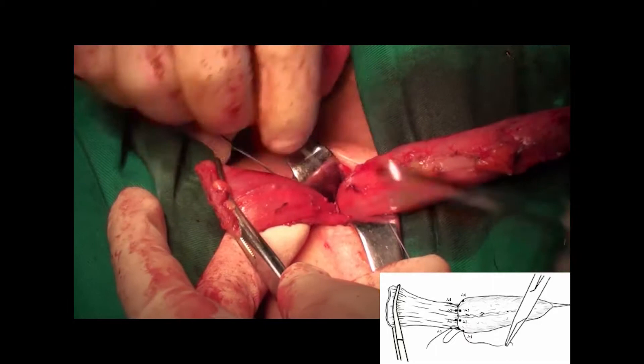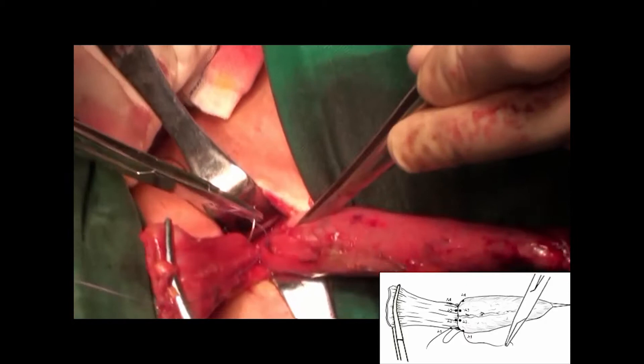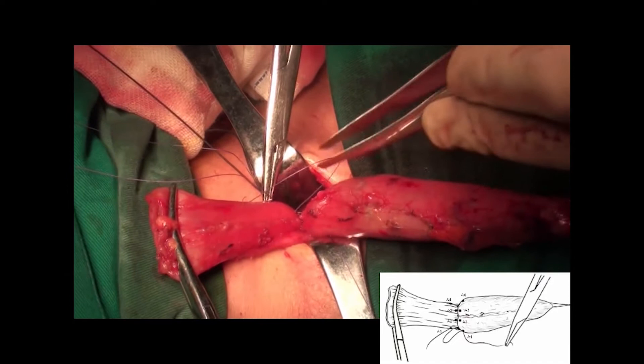A2 and A3 spots are sutured. The last suture was placed at A4 spot.